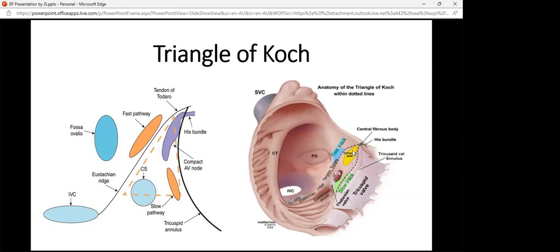So I was just saying that with any patient that I see, whether it's an implant or pacing, or during a follow-up, I always perform a VA conduction test. The reason is, you're never going to get the detail of signals that we get inside the heart like an EP study, if you've only got 2 leads. But what you do see is you can either rule in or rule out VA conduction.